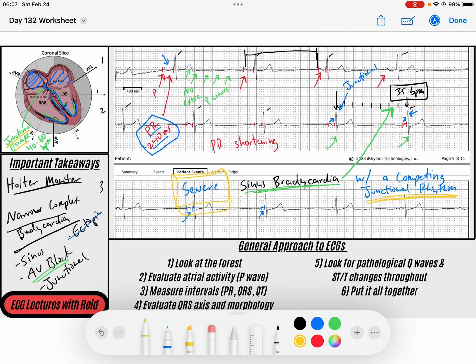And a lot of you out there in the healthcare world get telemetry strips, people in the ambulance, all sorts of monitoring devices that we use.